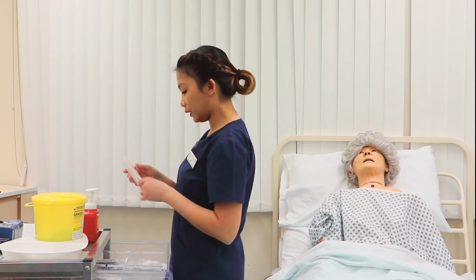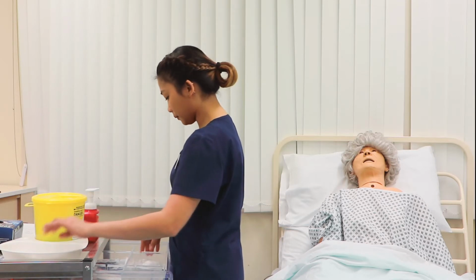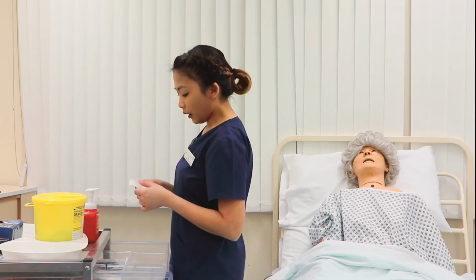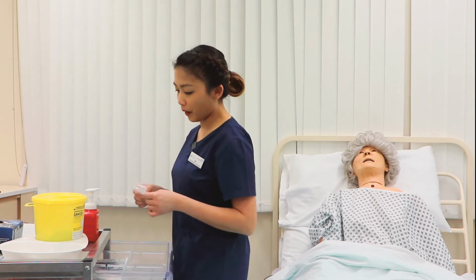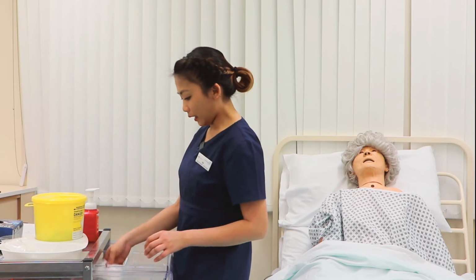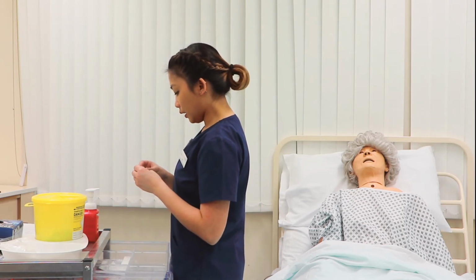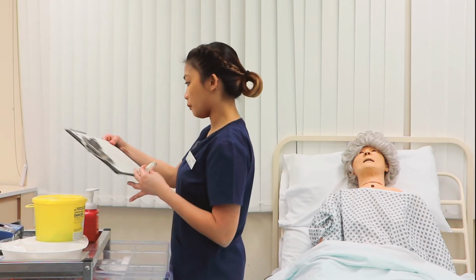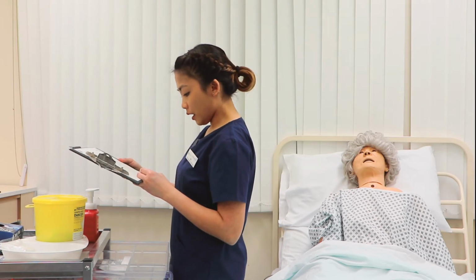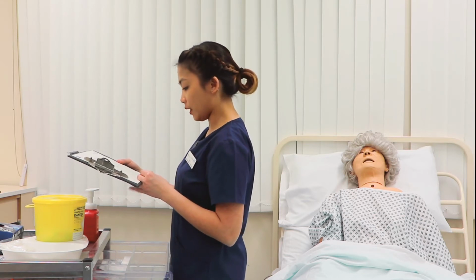My injecting needle, clean, dry, and intact, expires 2026. Cotton balls, I will make sure that they are clean, dry, and intact, and from a container which has not passed the expiry date. And my medication, insulin glargine, 100 units per ml, counter-checking it with my prescription. It's not past the expiry date of 2025, and it's not open past 28 days.